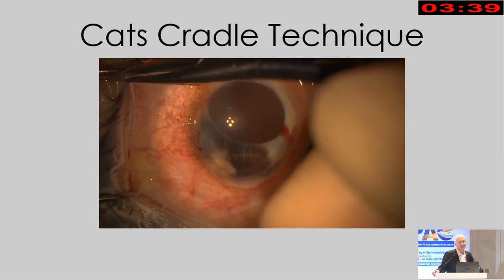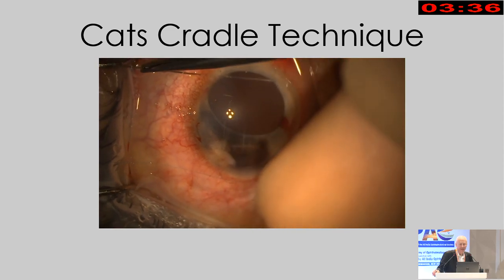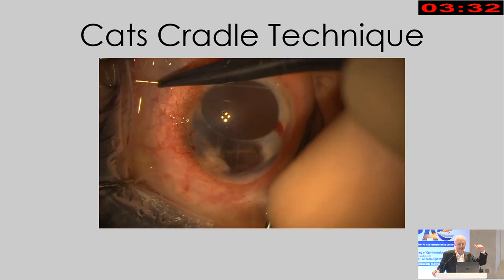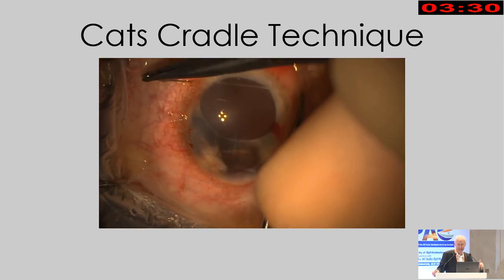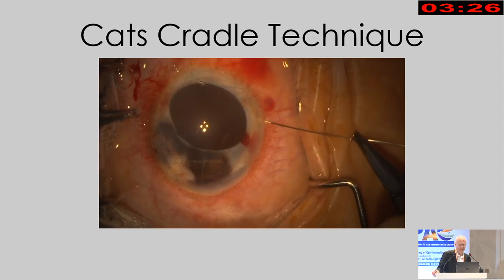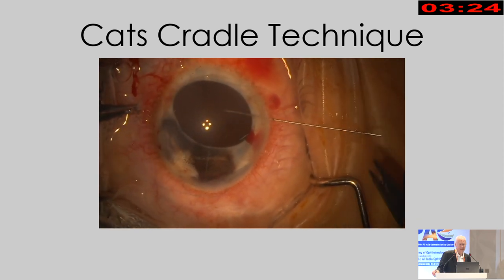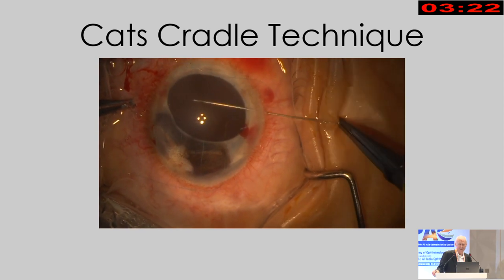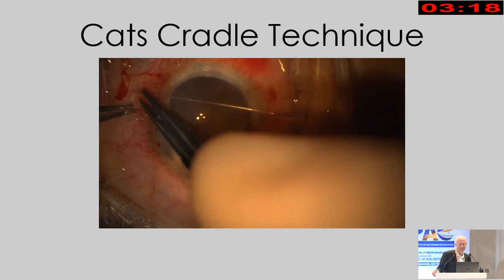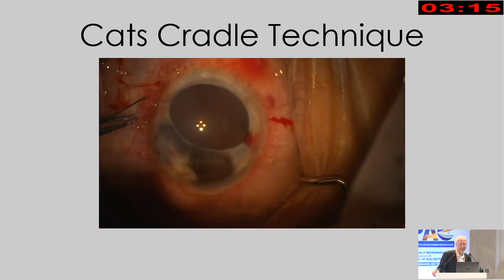And finishing up where we started. And this creates a really nice, shallow, pseudo anterior chamber, and makes it very easy to unfold the donor subsequently. And again, it's a technique that looks more technically difficult than it really is.